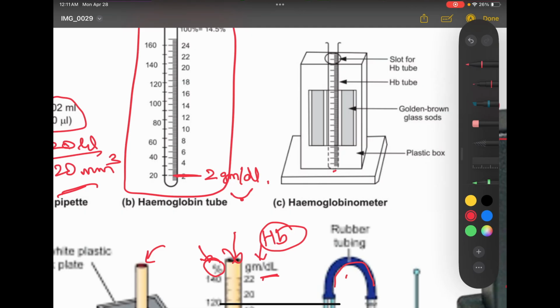utilize gravity. So, for example, this is your one drop of blood and this is your pipette. Your pipette should always be slightly in the down position so that with the help of gravity the blood will automatically slide into the pipette, and the tip of the pipette should be immersed inside the drop of blood. You are not supposed to lift the pipette up. If you lose any contact between your pipette and the blood, what will happen? Air bubbles will get filled inside, and that's a problem. You can't proceed with an air bubble because it's going to give a false, lower value.